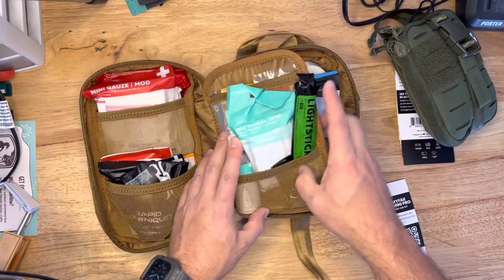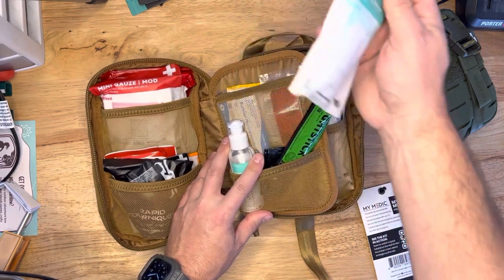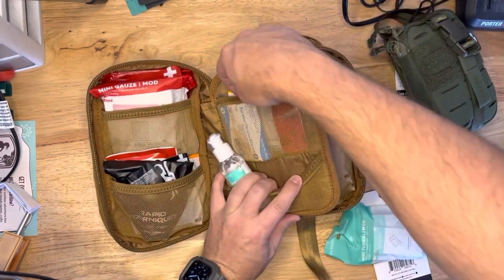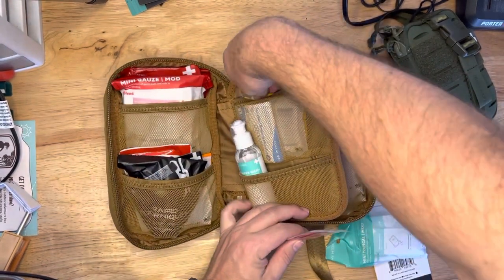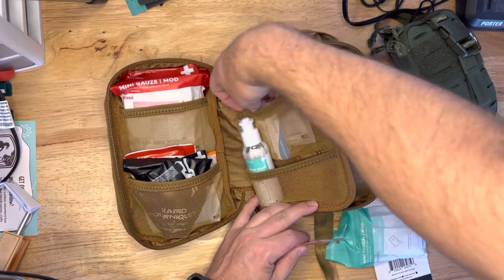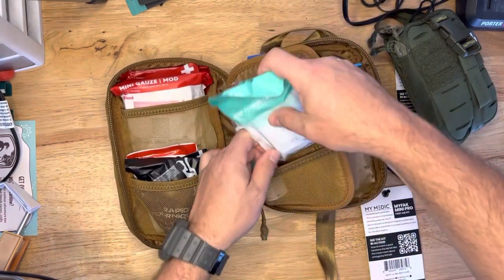Here we've got a lightstick, topical mod. So you've got some basically like cleaning pads, some wound irrigation, and that stick is actually handy if you can't see. You've got some super skin band-aids here, which are awesome — I love their band-aids. Ibuprofen packs, some painkillers. And it looks like an emergency blanket. This is a really full kit — this comes with a lot of stuff.